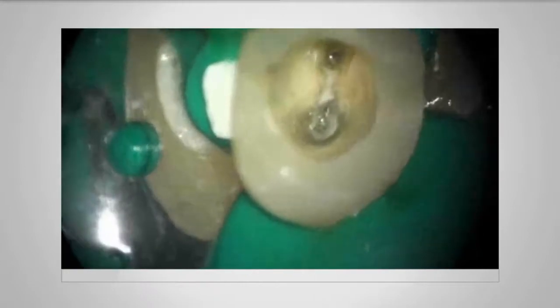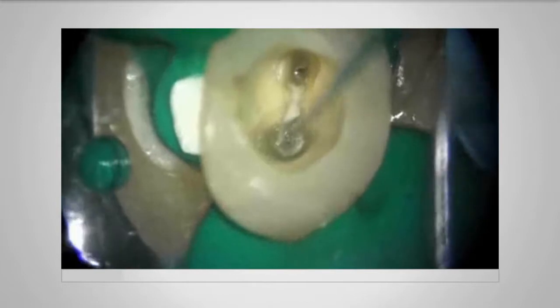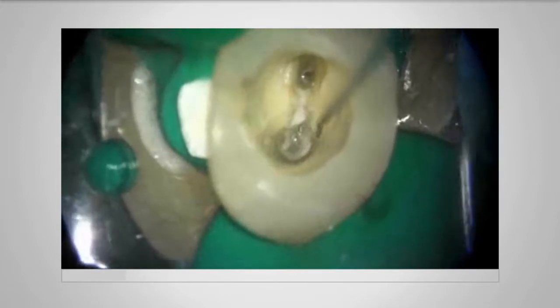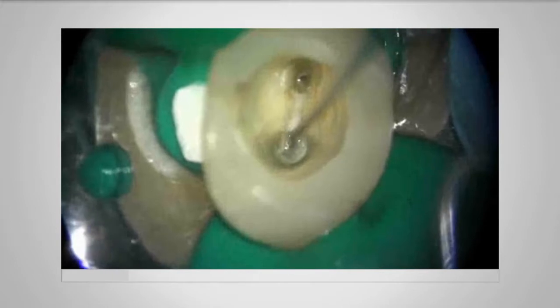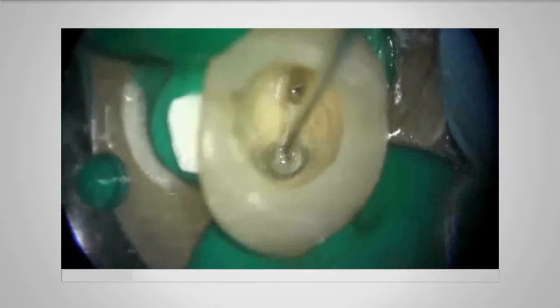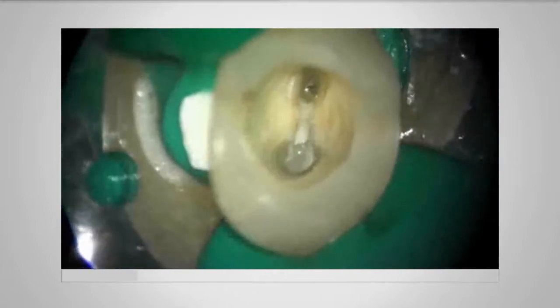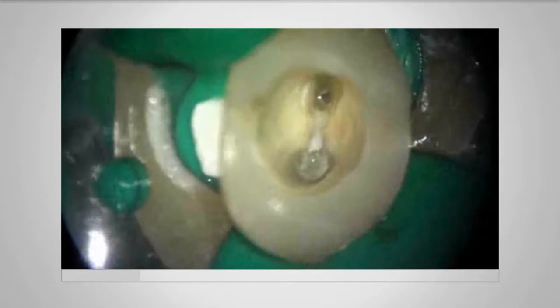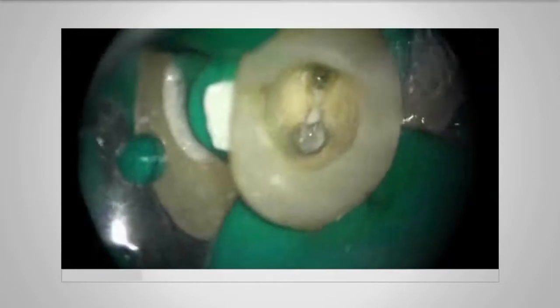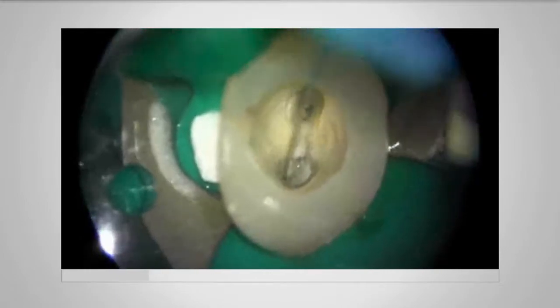And now using a micro opener to see whether there's any patent root canal. I'm just seeing whether it will catch. If you use a rotary instrument, then the orifice generally shows up as a little white dot. And now this is with a size 6 file. I'm just starting to be able to get into that root canal.